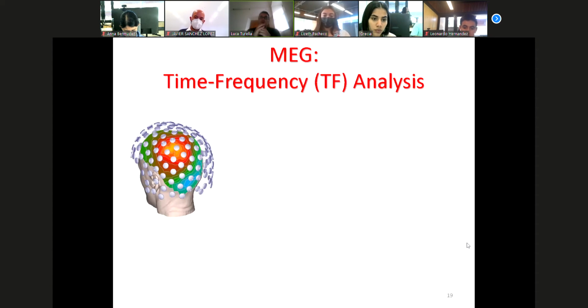As I said, the beauty, but also the difficulty of analyzing and using MEG is that MEG, with respect, for example, to fMRI, has this kind of high temporal resolution, which makes the data that you analyze very complicated and very complex from the temporal point of view. It's like you have a photo of the brain every millisecond or every few milliseconds, whereas in fMRI you have just a nice picture, but that is related to 1 second.